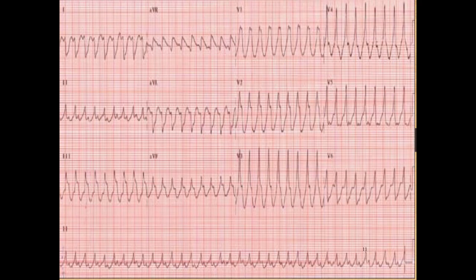Do I have AV dissociation? Well, nope. If we look in V2, we see P waves. And P waves are just a dead giveaway. So we have P waves, and they are associated one-to-one with each QRS complex. The PR interval looks fairly normal. We're good there.